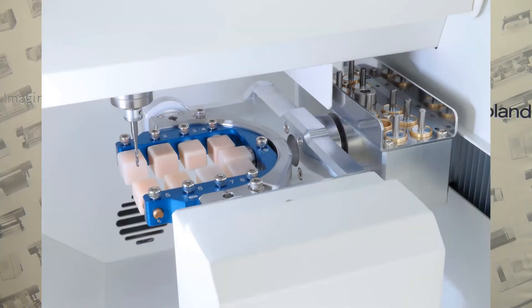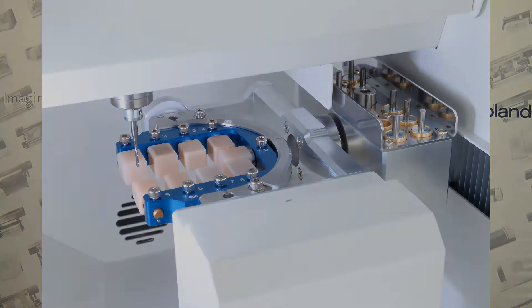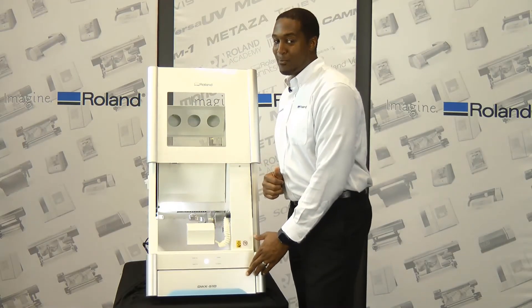By pen-type, we mean the block-type material. We have an adapter here that you can use to install your pen-type material and mill on the DWX51D.